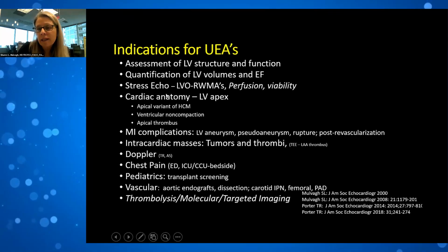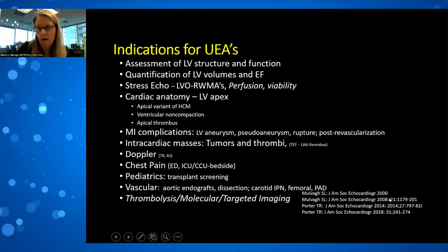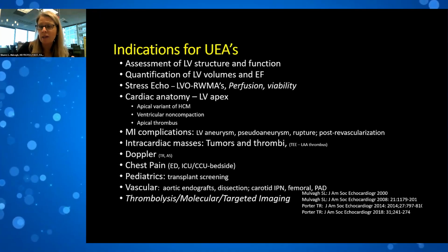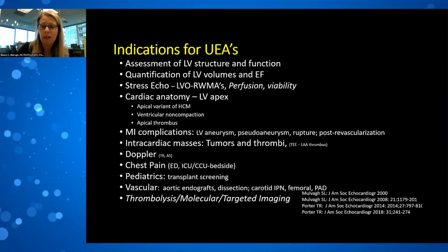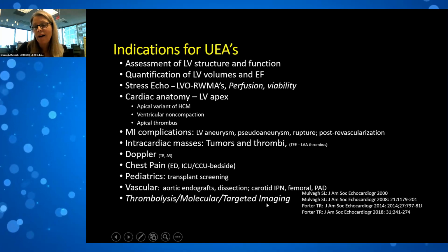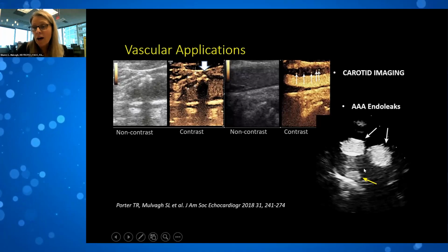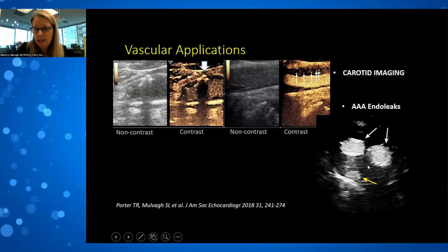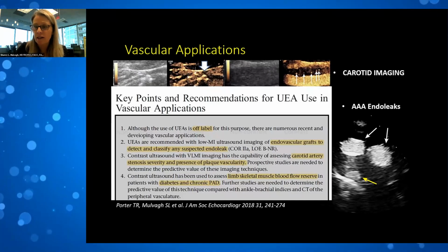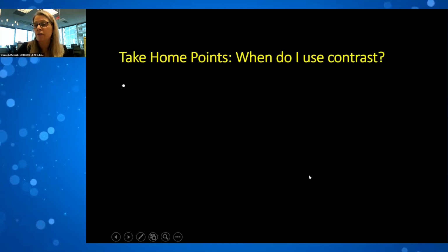So in summary, I've quickly gone through with case presentations what the indications are for our ultrasound enhancing agents, and this comes from our guideline documents, with cases where you need to think about ultrasound enhancing agents being helpful in your lab, in your everyday practice, as well as evolving to some newer applications that you should watch for coming down the pike. Endovascular leaks, that's another very exciting avenue. I'm sorry, this is not playing for me right now, but instead of having to do serial CT assessments on these patients that have had aortic endovascular repairs, looking for microbubbles extravasating can be very, very helpful.